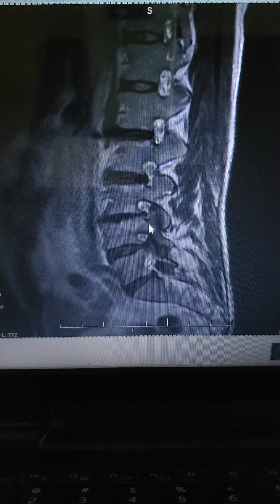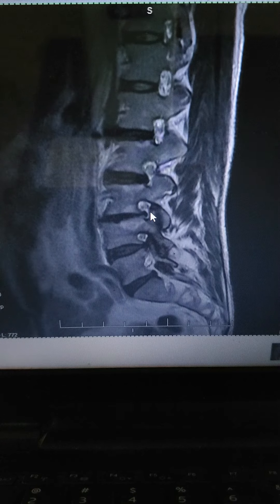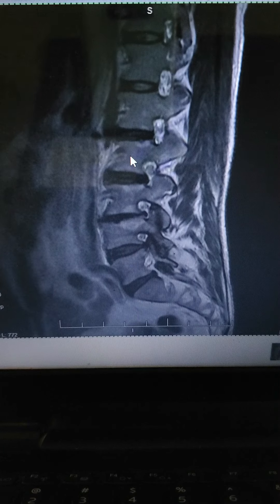So these nerves are getting severely pinched, causing pain — radiating pain down the buttocks, hips, and legs. We'll switch to an axial view and show some more.